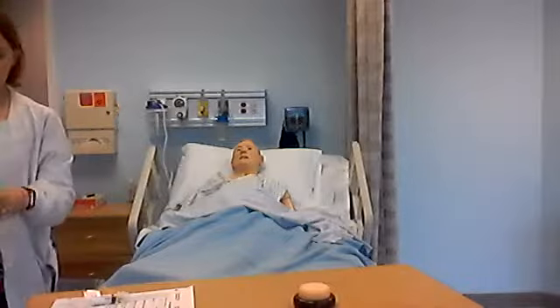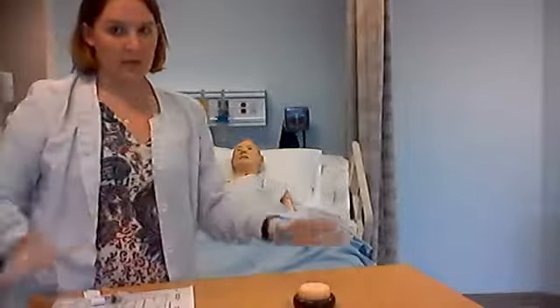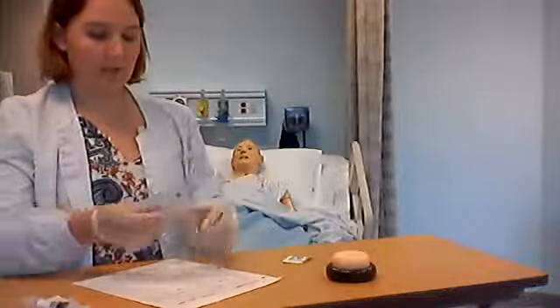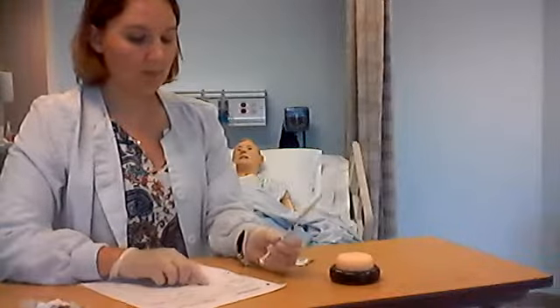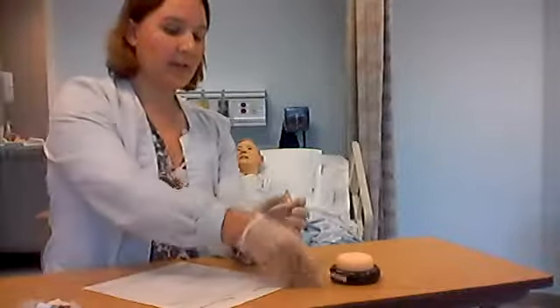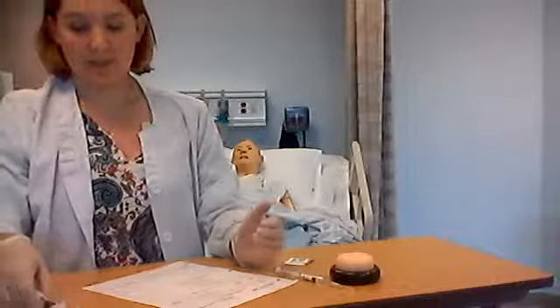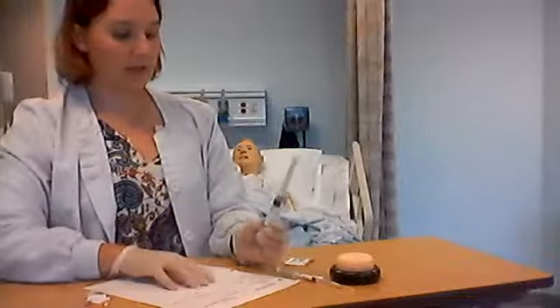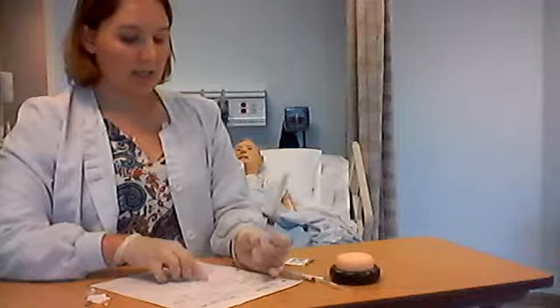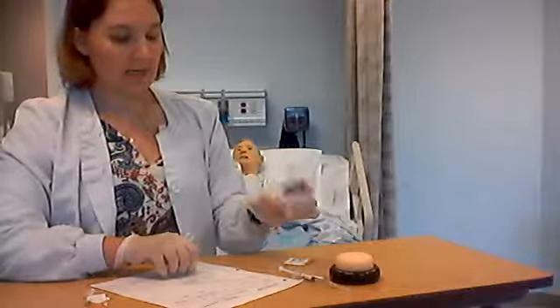So I'm going to come over to my table, set up so you guys can see. And I'm going to do my third check on my medications. So I'm going to start with my heparin. You're checking your 6 rights. So, patient, Mr. Walker, right drug, heparin, right dose, 5,000 units, route sub-Q, time is now, I will document at the end. You need to state all 6. Same thing for my intramuscular injection. I have Terrence Walker, right patient, right drug, hydralazine, 25 milligrams, IM, time is now, document at the end.